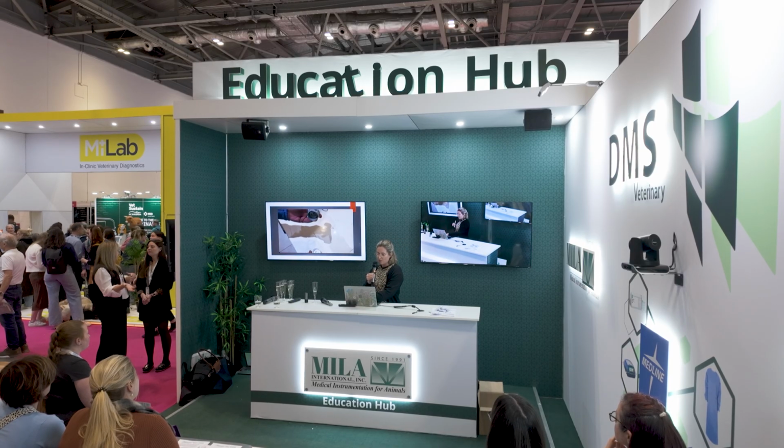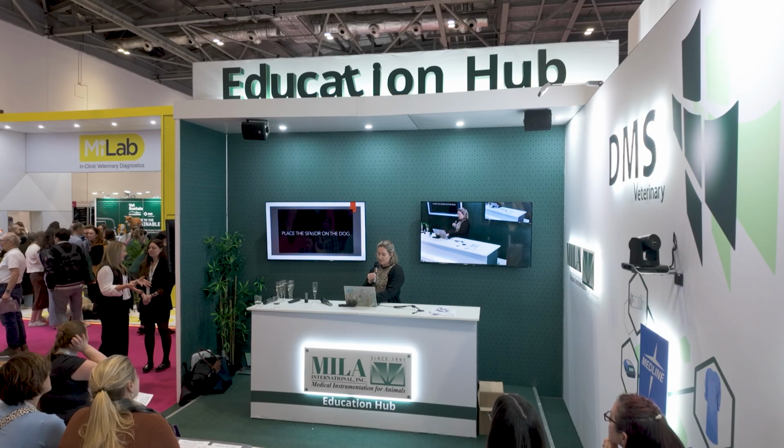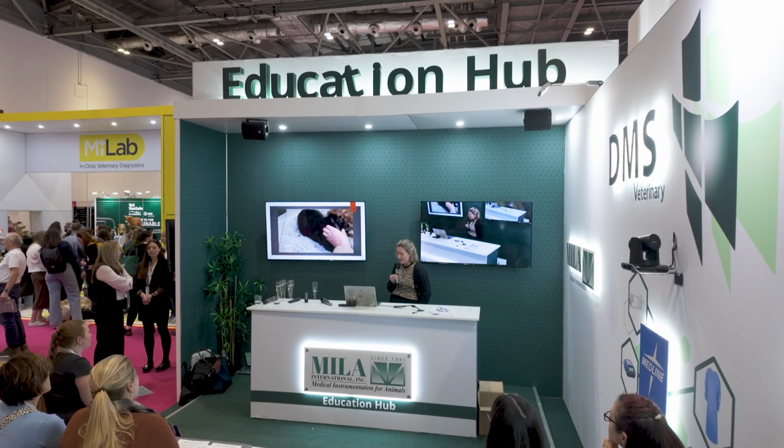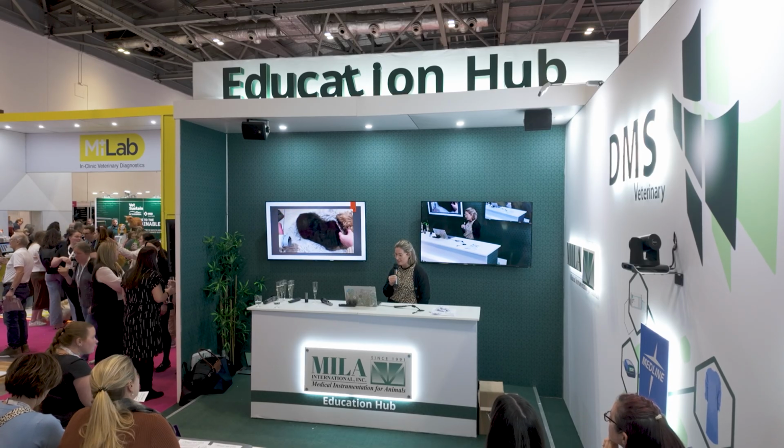You're going to then twist off the bottom, and you'll see then that the sensor is loaded in the bottom here. So then to place it on the patient, this is Ruby, this cheeky little border terrier. She's got her little clip patch of hair all ready and prepped to go.